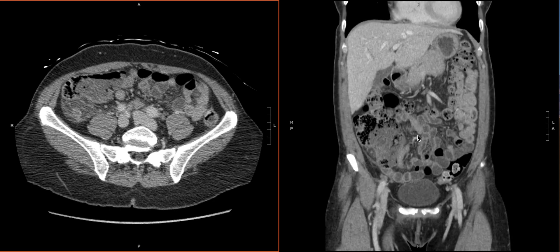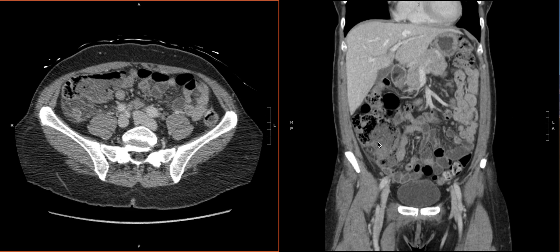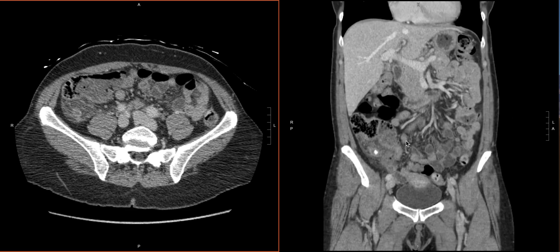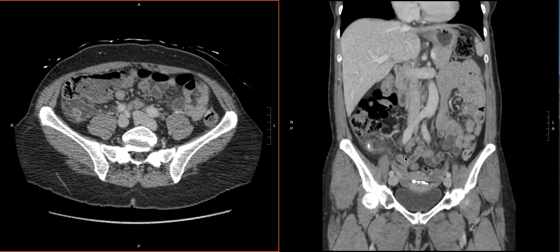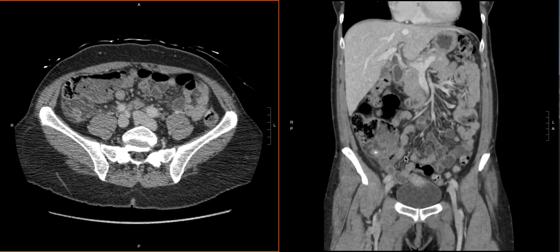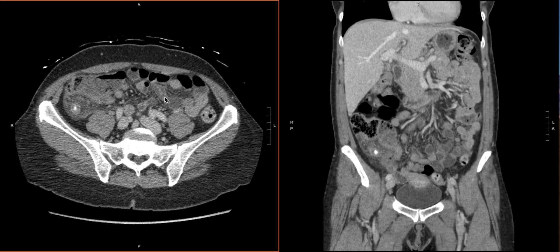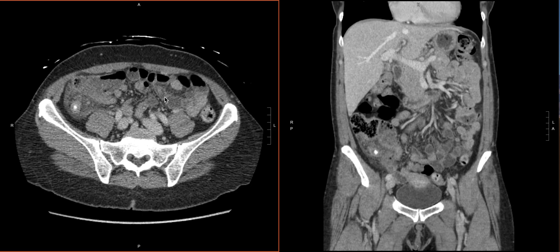So, ileocecal valve, and then coming backward, there is our terminal ileum right here, which plugs into it. That's what we see here on the axial as well. So we have our terminal ileum, we know the ileocecal valve, and this is the area of the cecum where we would expect the appendix to come off.